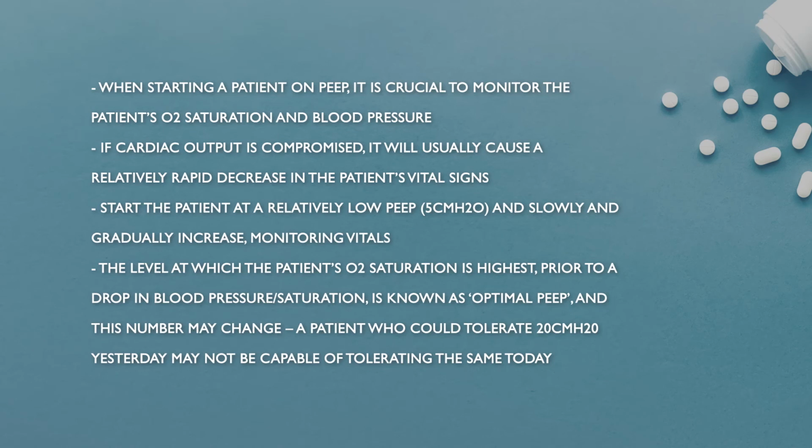A patient on a ventilator must be monitored at all times. We have alarms on the vent. There are going to be alarms on all of the vital signs that are monitored, and it's very important to be watching these things at all times.